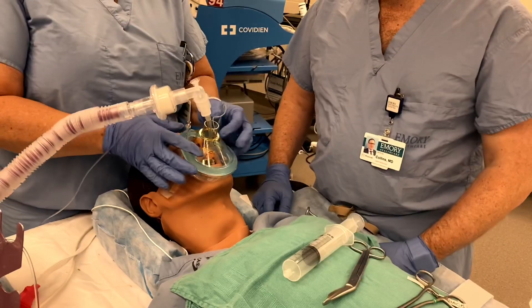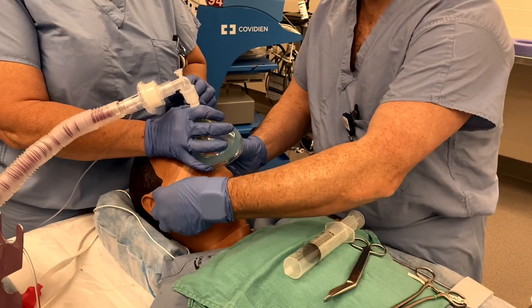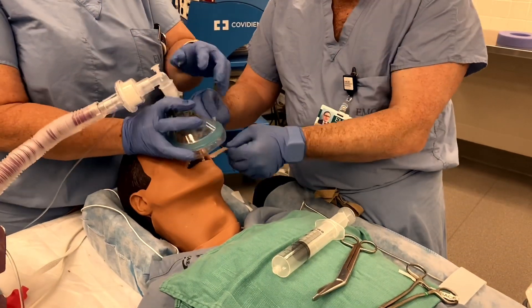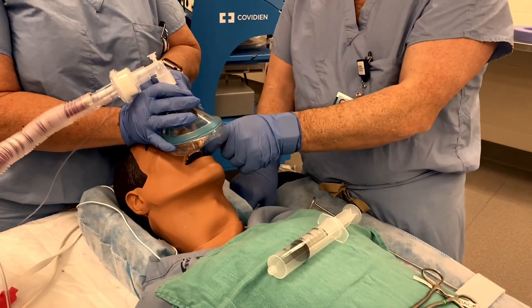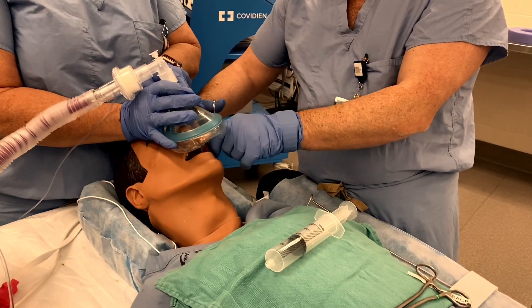As you then go about the last few minutes of your case and starting to reverse your patient, one person will be in charge of just holding and securing the tube, making sure it doesn't move, while your colleague will cut the tape off so that the mask comes through easily and does not stick.